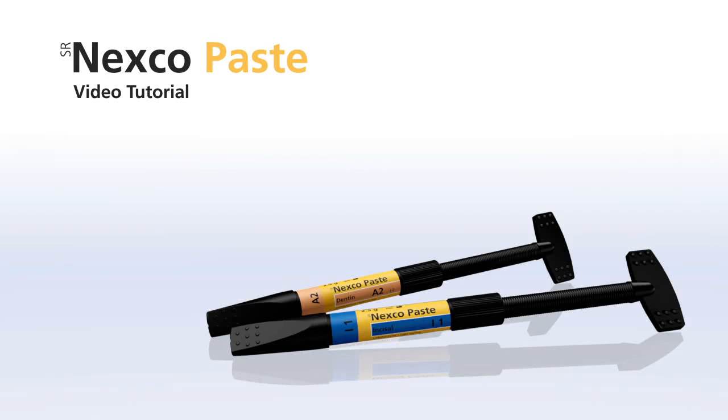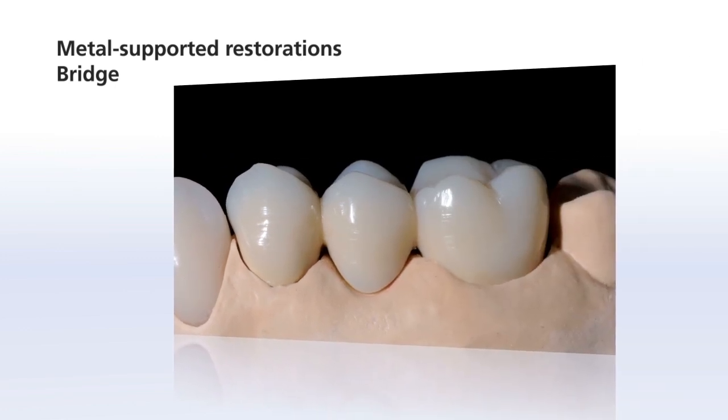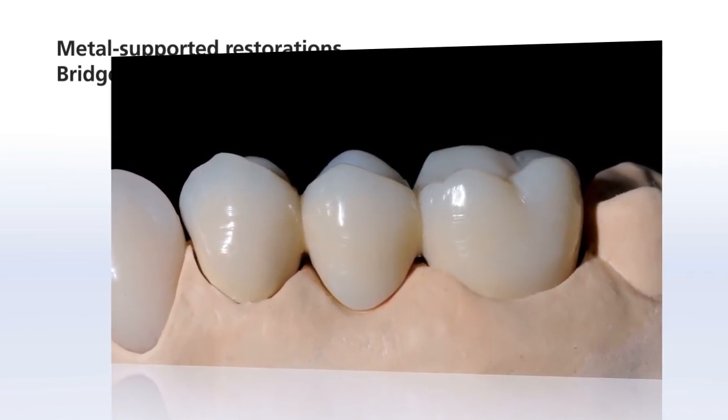Welcome to the SR-NEXCO video tutorials. This chapter shows you how to create a metal supported posterior bridge with SR-NEXCO.